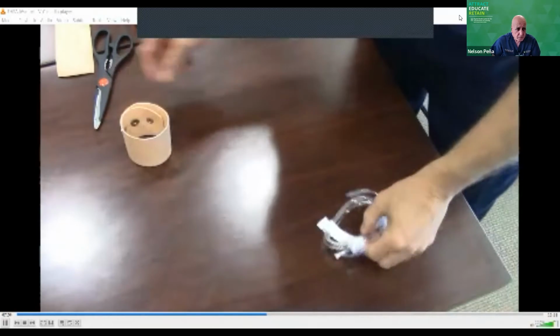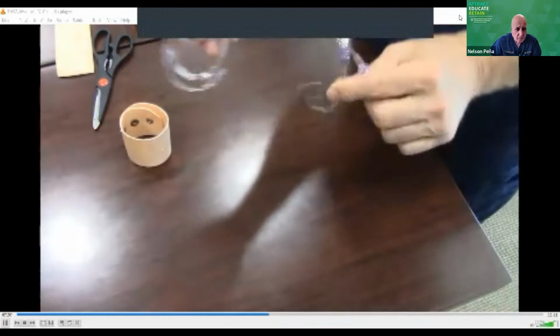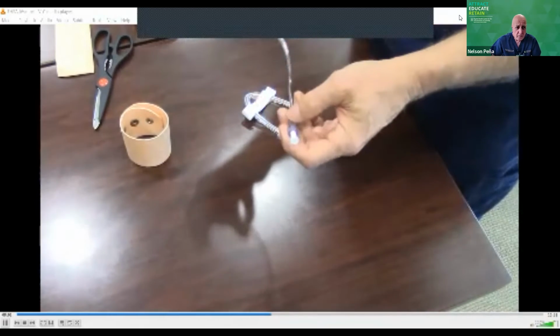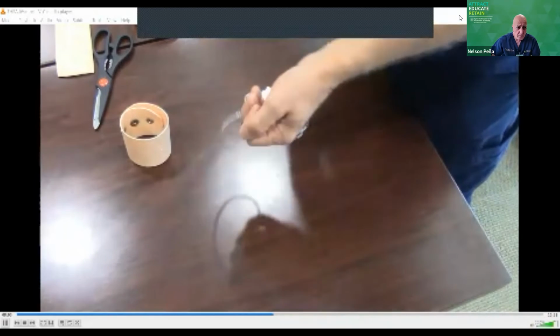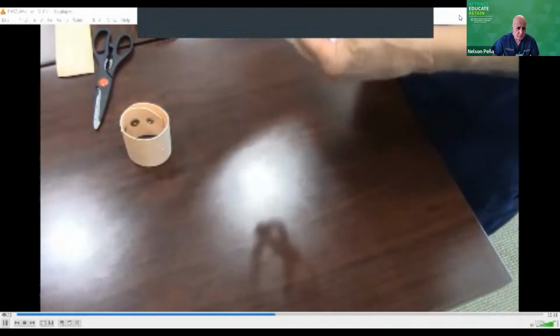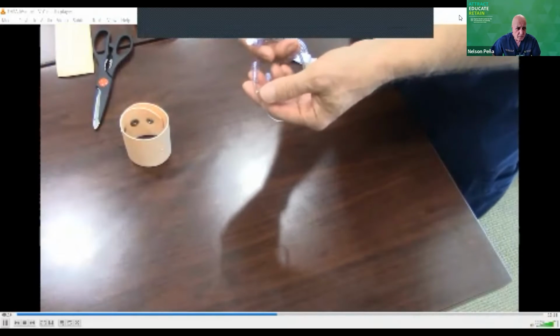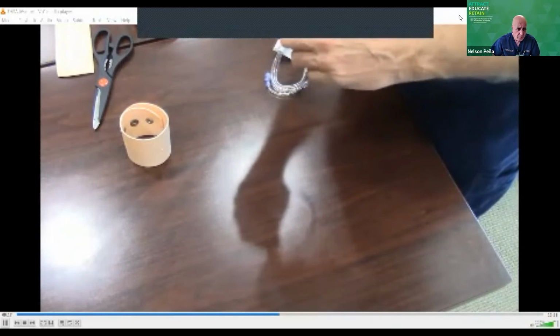Alright, so what I used for tubing was an A-line kit. The tubing that comes in an A-line kit. This is usually the little short one that goes right from the catheter to the connection point, and then this goes to the pressure monitor, to the transducer itself. So I'm going to use the little short piece as my hub of the IV.